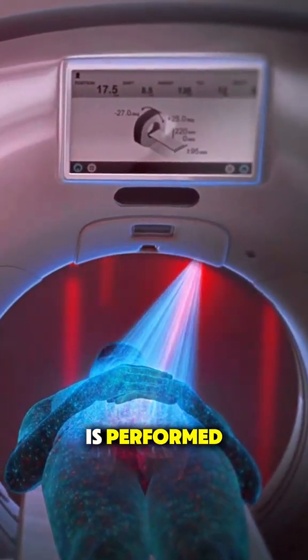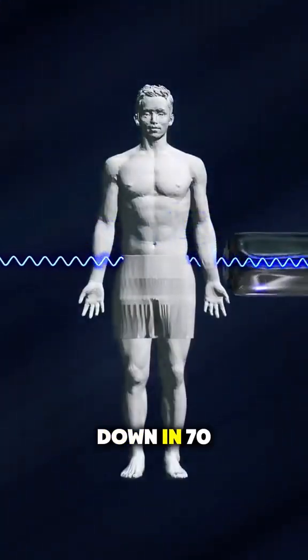Have you ever wondered how a CT scan is performed? Let's break it down in 70 seconds.